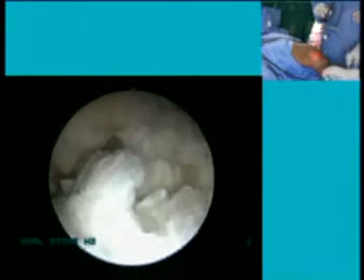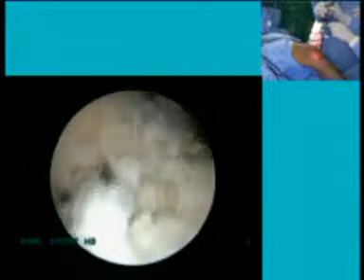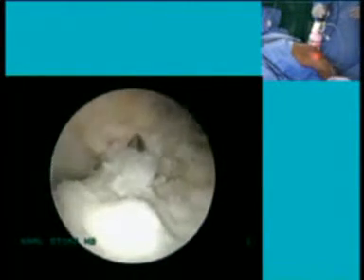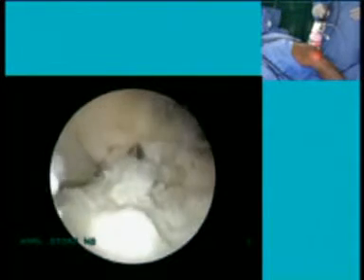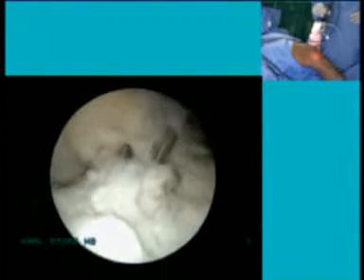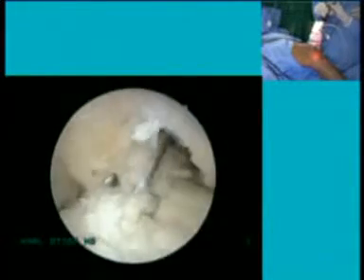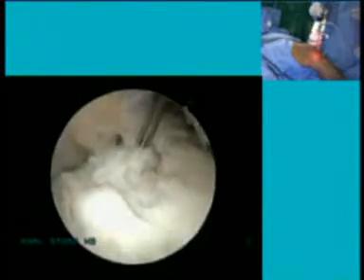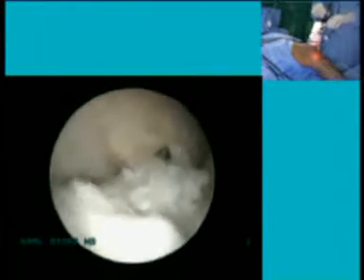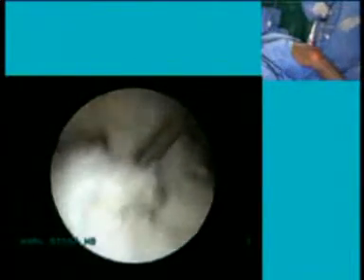Okay, and then I take the same for the AM. Or maybe give me the 5.0. This is maybe a little bit too medial. I think the first important thing is you must be sure that you have enough footprint. First, we should match the tunnels you are supposed to prepare depending on the graft available, and at least 2-3 mm width should be there.